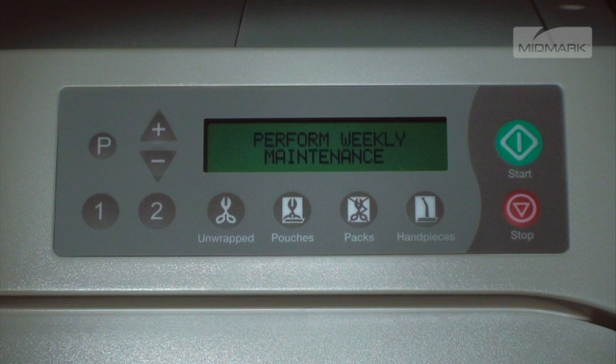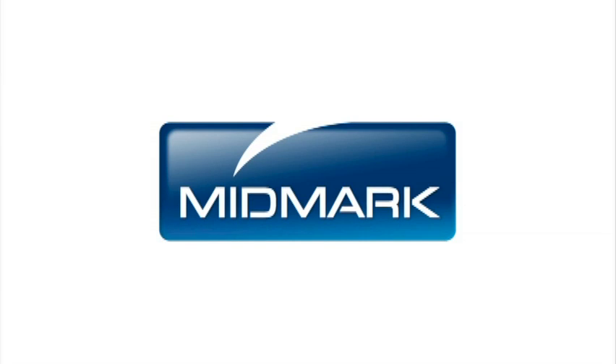Refill the reservoir with distilled water until the water level indicator is in the green area. The Perform Weekly Maintenance message will go away during your next sterilization cycle.